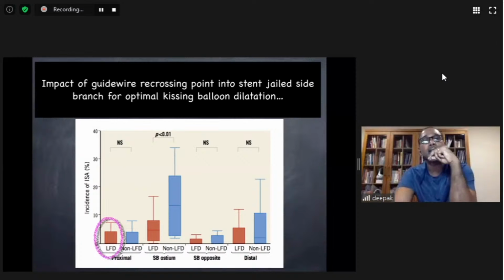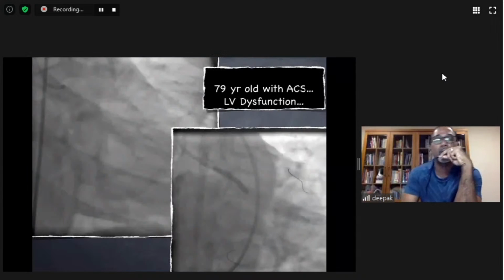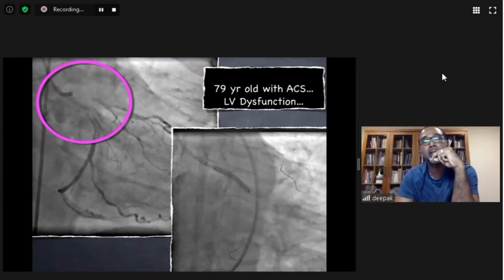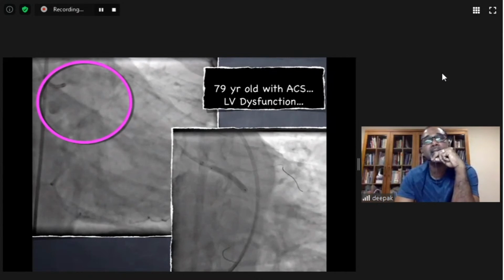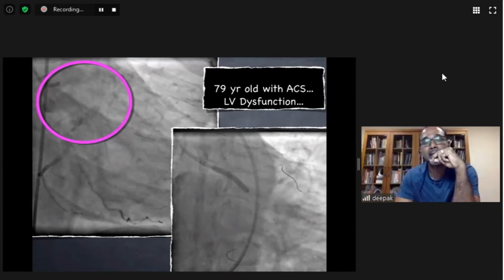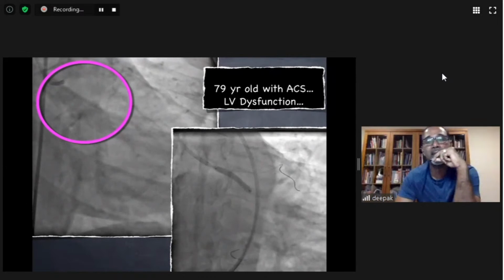So this is the information that one could achieve with the help of OCT following a stent implantation across the bifurcation. We also have small data that suggests that when you have a linked bifurcation, the stent apposition is not going to be great. But one should also keep in mind that all these things are seen after the stent implantation, and you do not have real control over whether you are going to have a link at the carina or a free carina.